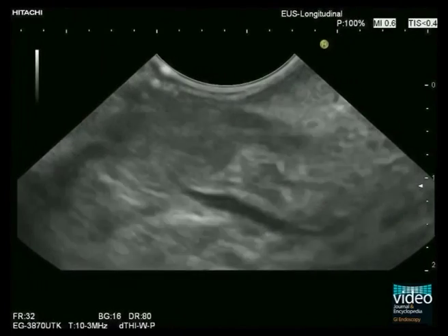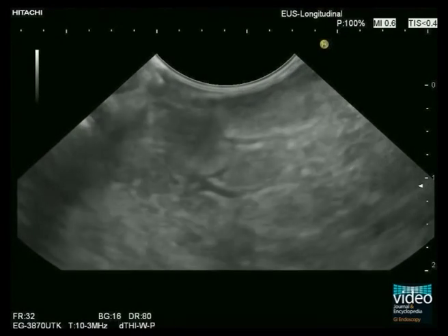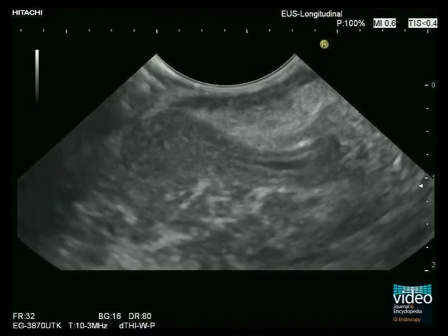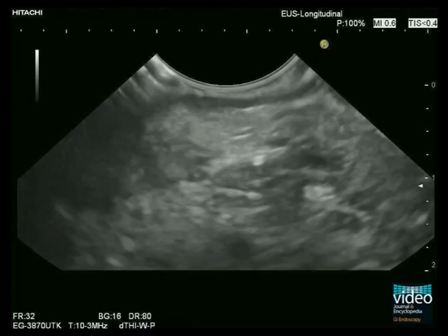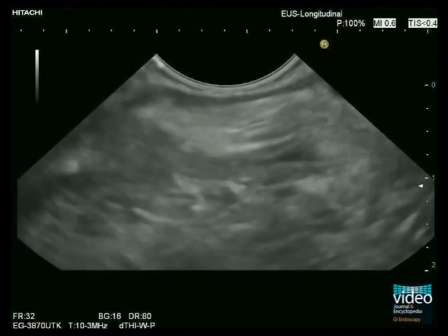This is a very similar case of biliary pancreatitis. Using a longitudinal echoendoscope, edema of the papilla and of the distal bile duct wall is observed. Beyond any doubt, acute pancreatitis may be attributed to the spontaneous passage of a bile duct stone.